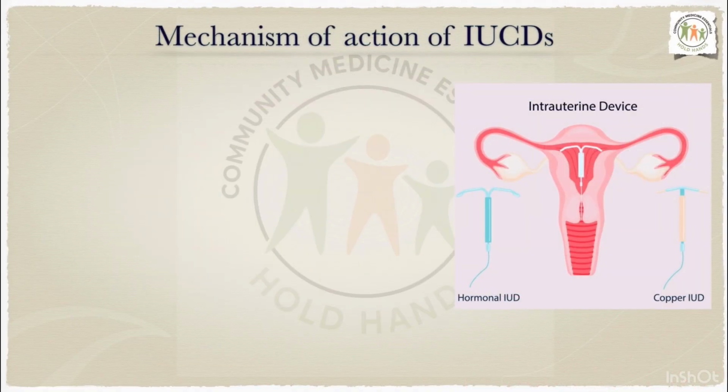Next is mechanism of action of intrauterine contraceptive devices. First point to remember is that IUCDs do not inhibit ovulation.